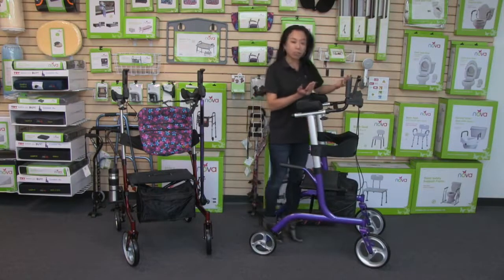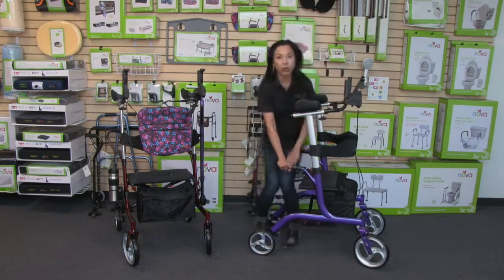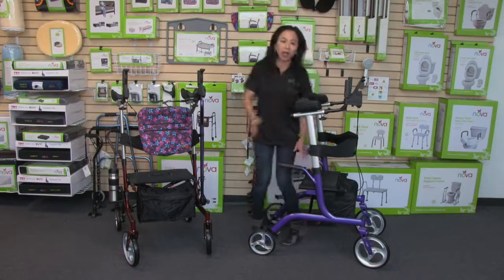Before you sit down, you're going to want to lock the brakes. Then you can take a seat very easily by holding onto the handles. You can sit down and have a very comfortable seat on the Phoenix, and then use the handles to get up as well.